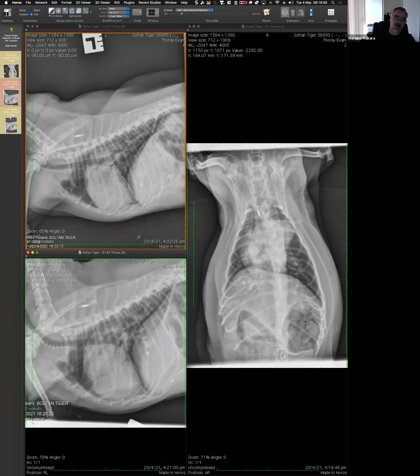So if you're going to think about the options of edema, severe edema, contusion, there's nothing very clear along those lines. I would probably rephrase it like that, and I would agree with that. Okay. I guess most commonly, if they're dyspneic, you either have significant edema or you have pleural effusion or you have something going on. Do you know what I mean? But cats can have the mildest signs and be dreadful. I completely agree with that.